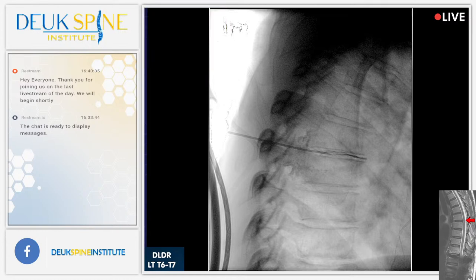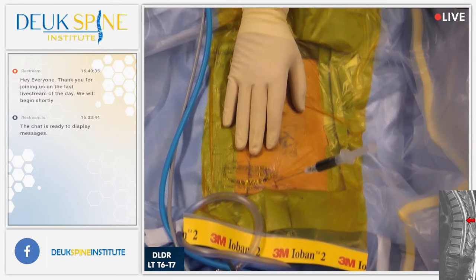I'm going to give her another minute. We're going to see if we can get her a little more awake. And I'm going to test. Can you open your eyes? Hi. Turn that off for a second. Ask a question now, okay? Don't move. Okay, we're waking up. Sorry. This is Dr. Deuk Majan. Can you hear me? Say yes or no. She said yes. How you doing? Lay still.